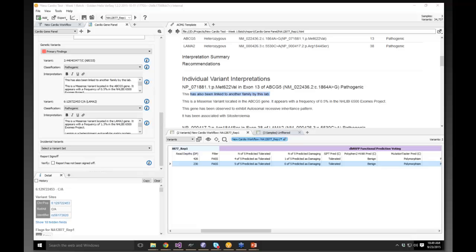Can VarSeq detect highly variable length but specific insertions like FLT3 ITD and call it as an ITD based on its exonic location? Right, so with highly variable length polymorphisms, it's not really VarSeq that's the issue, it's that NGS and variant callers themselves have a very tricky time describing these in a uniform and useful way. That said, if your NGS pipeline calls that variant in a meaningful way, there are definitely ways to handle those in VarSeq, but I would certainly say you're a little bit on the frontier of standard NGS gene panel testing if that's something you're trying to get into production.